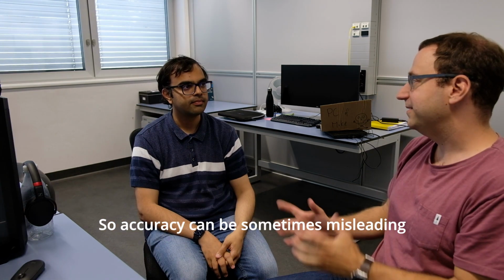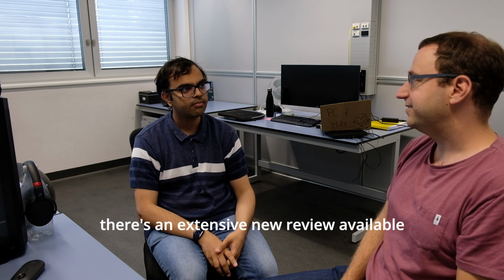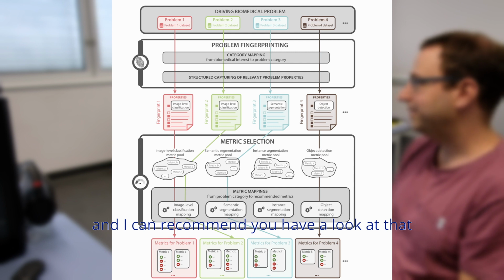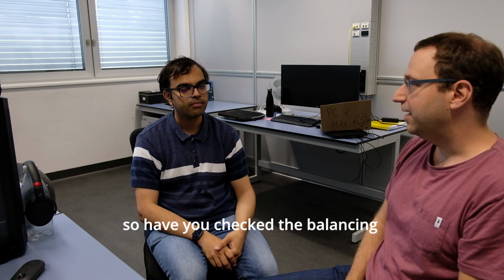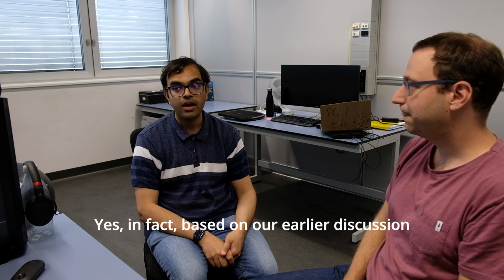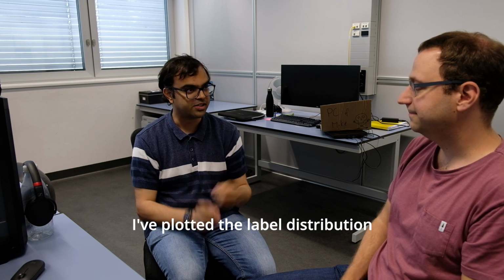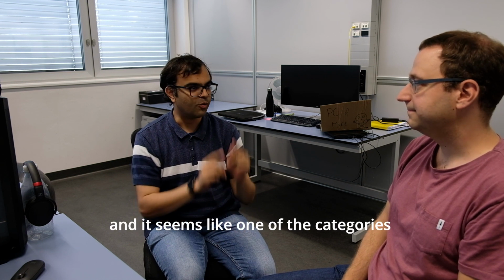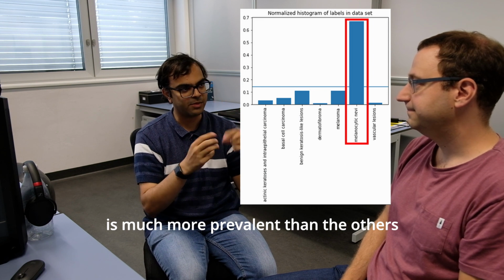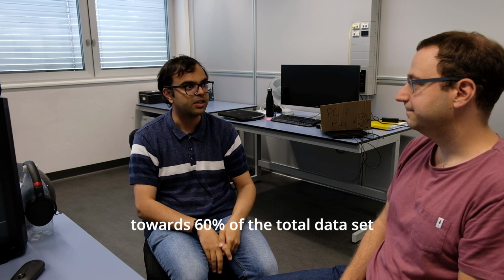So accuracy can sometimes be misleading, especially if your dataset is not balanced. There's an extensive new review available called Metrics Reloaded, and I can recommend you have a look at that. So have you checked the balancing of your classes in your dataset? Yes, in fact, based on our earlier discussion, I've plotted the label distribution, and it seems like one of the categories is much more prevalent than the others, which might lead to trouble. In fact, it's super dominant, about 60% of the total data set.